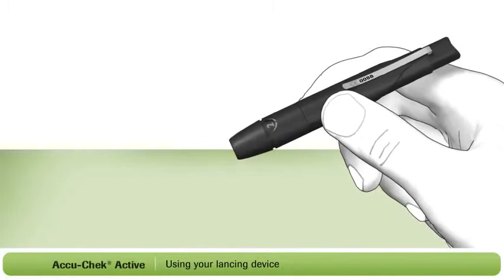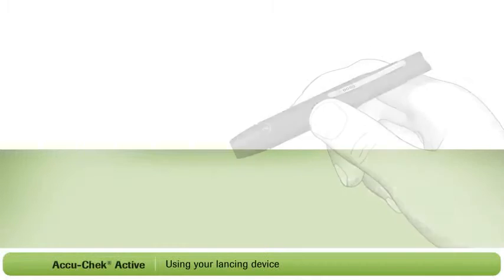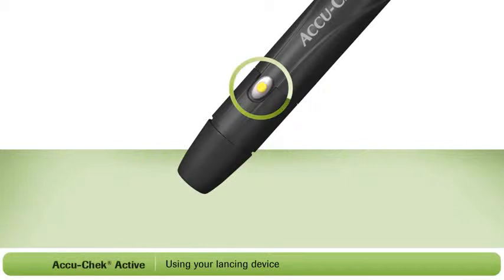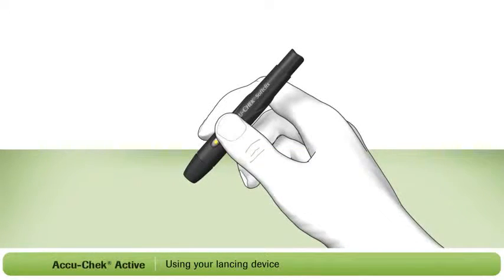You may need to adjust the setting a couple of times until you find the right level for your skin type. To use the lancing device, you first need to prime it. Press the plunger all the way down. The release button on the side of the lancing device has now turned yellow. This indicates that your lancing device is now primed and ready to use. Press the yellow button to release the lancet. This will lance your finger.